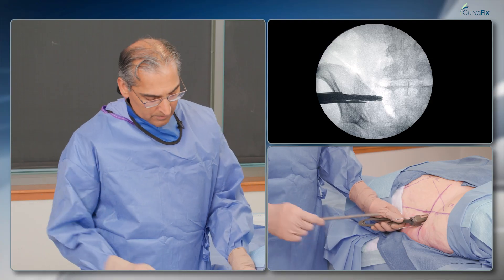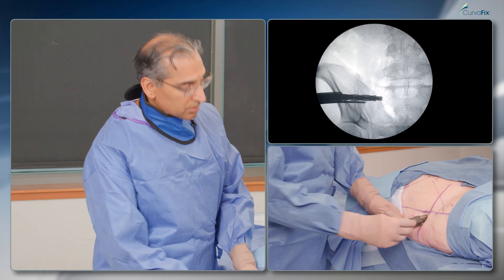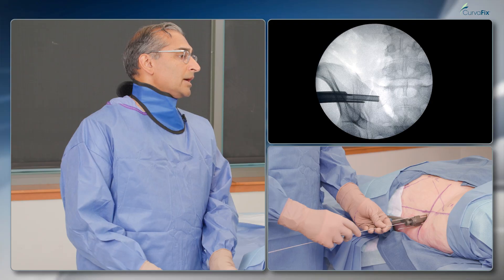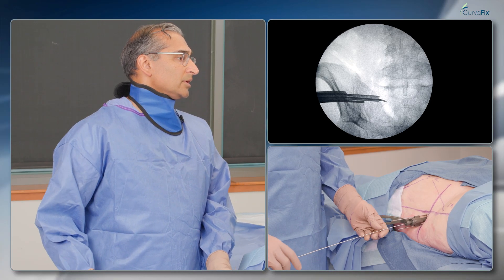I'll take my ball tip, which goes in the corridor that I just drilled. That's protected. I'll insert the ball tip — nice safe wire above my tunnel. You can see I'm just above my S1 there.